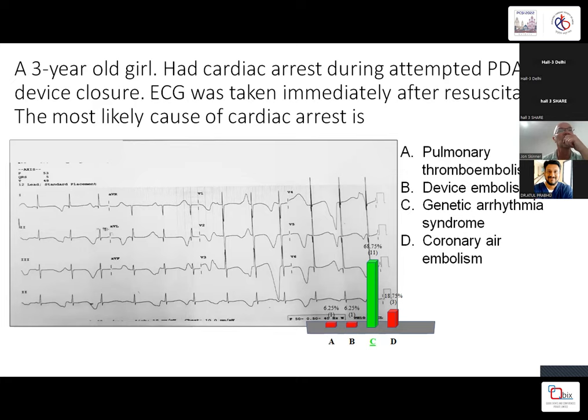You know, this patient had a cardiac arrest in Calicut, and they didn't identify that. And later on, we did a cardiac sympathetic denervation. Then he's doing fine. Next slide.